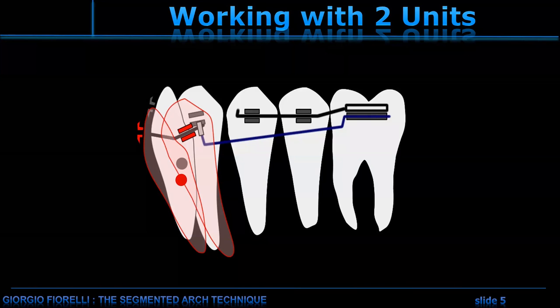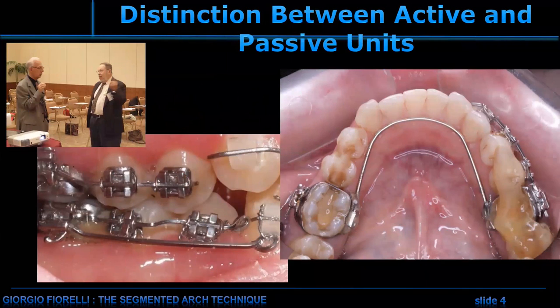So sometimes when we do these things that you see here, and we're going to discuss this, this will be your first exercise. It's something that I do every single day, more than once: bend the passive wire.